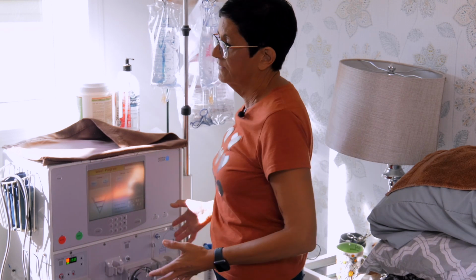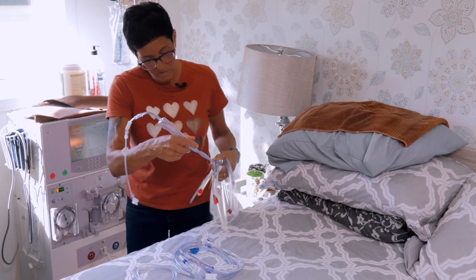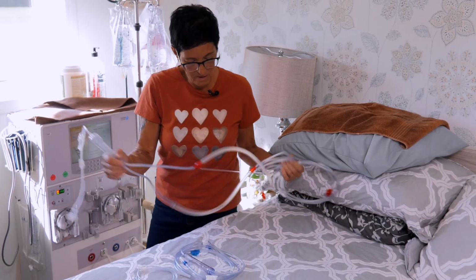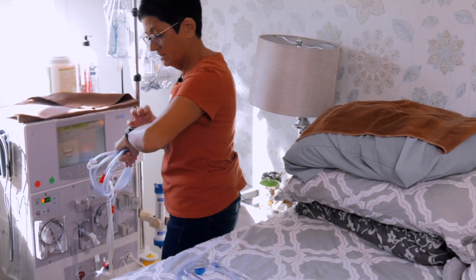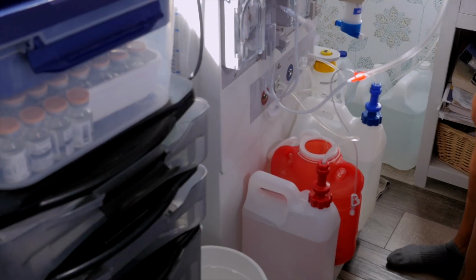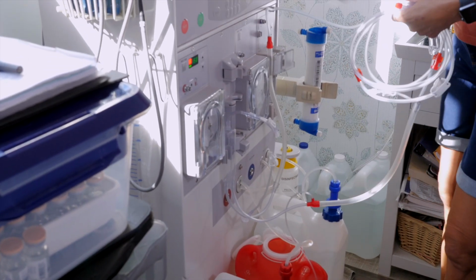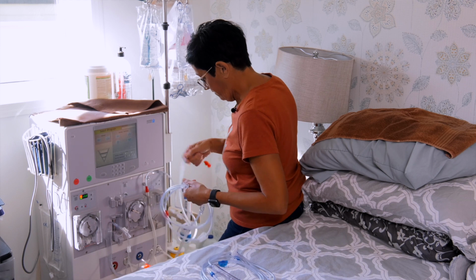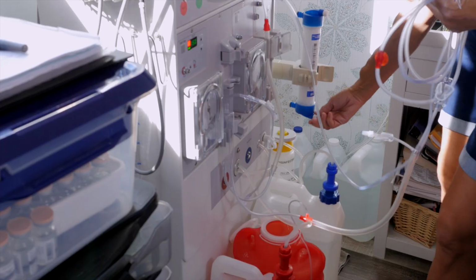Now I have to let it run for 10 minutes, and during that time, I'll start to put my lines on. And this is your arterial line you start with. Oh, sorry, check the time. So I run for 10 minutes with it. This arterial line is the one that brings the blood from me to the machine.